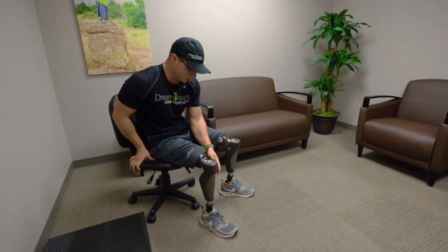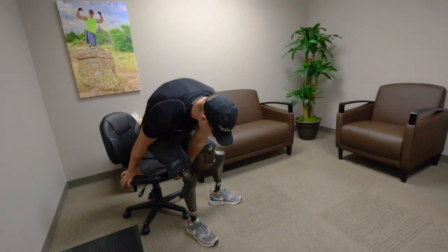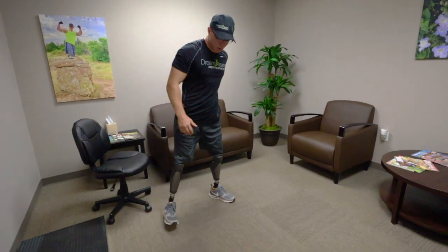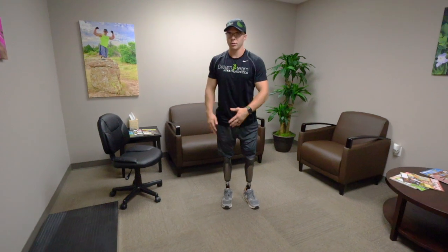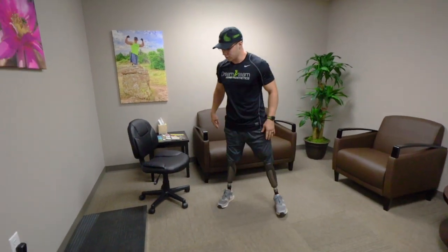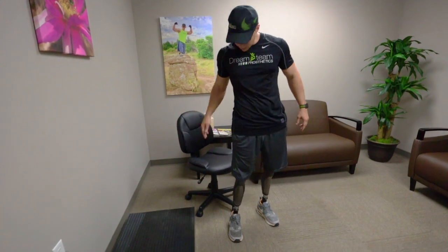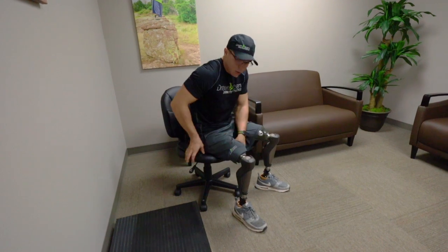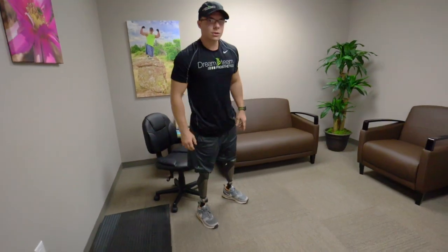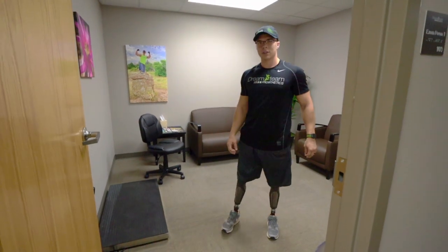Now to get up, you have to scoot to the edge of the chair a little bit so you can get your arm behind you, but you're still keeping that three-point stance and then just getting up like that. That way you don't risk the chair getting pushed out from underneath you. The biggest thing is to keep your body weight and center of gravity over the bend of the knee — just like that. Good, over and out.